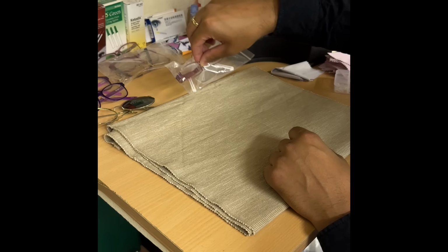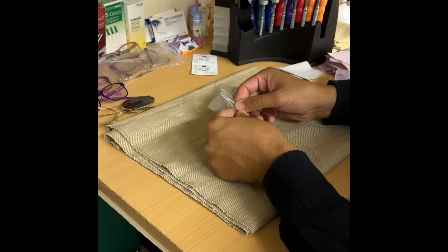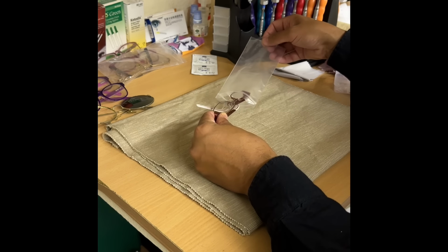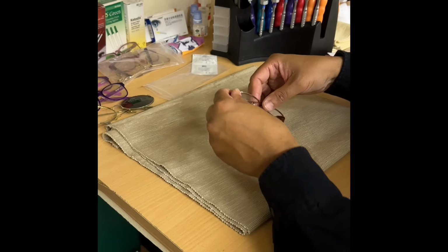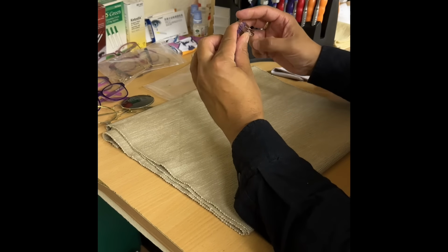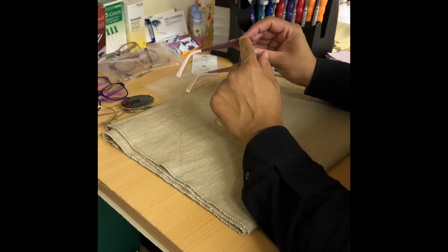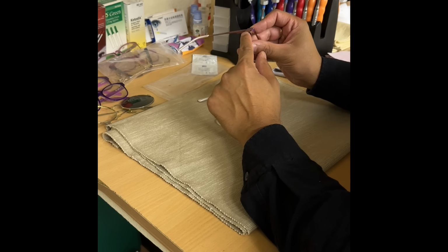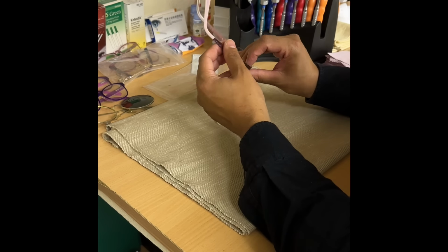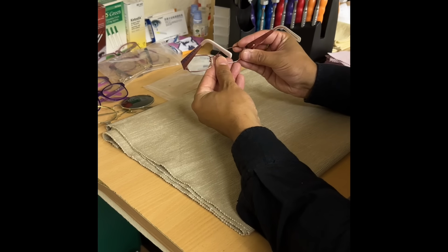Second pair. Let's have a little look. Okay, metal frame, white tips. Let's have a look at the condition. It's a little bit out of sync there at the side. That one is more squared off there. Tips are looking fine, I don't need to replace. Let's have a look at the pads.